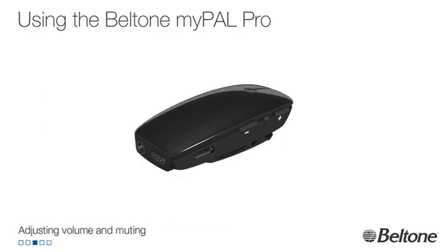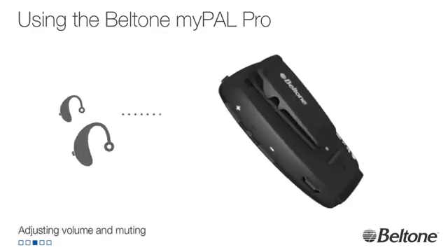Text, adjusting volume and muting. An arrow points to a button on the side of the myPAL Pro. Tapping the button increases the volume. The arrow taps a button below it to lower the volume. Tapping a middle button mutes the device.